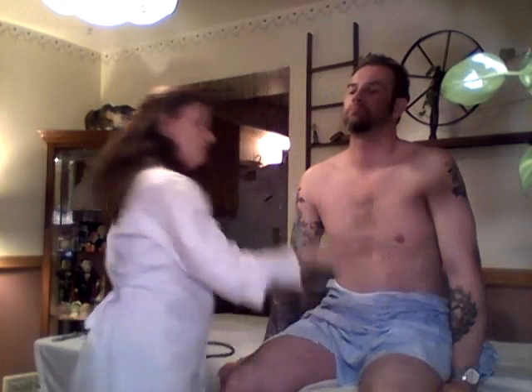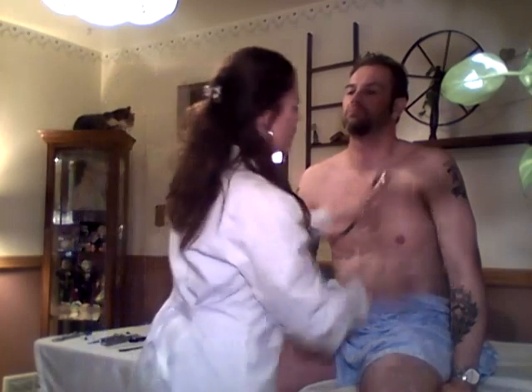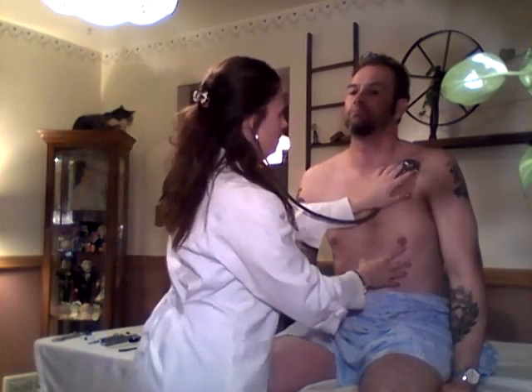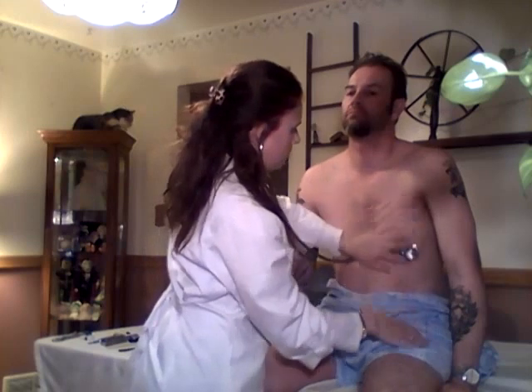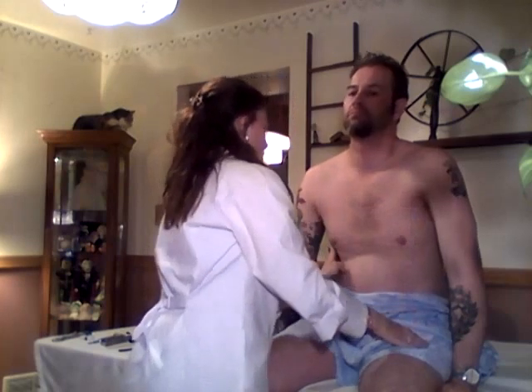Okay. And now I'm going to do an auscultation of the anterior chest and also of the heart. Listening for any adventitious breath sounds, such as rales, rhonchi, and wheezing. Listen in a systematic way, side to side.